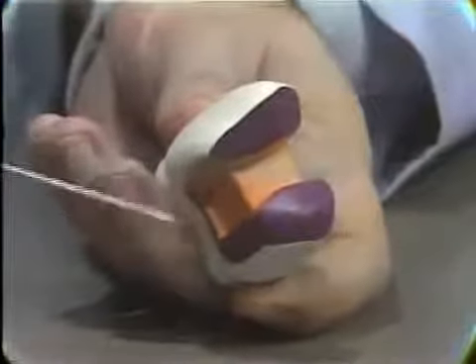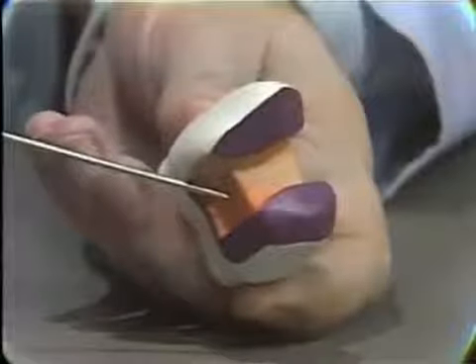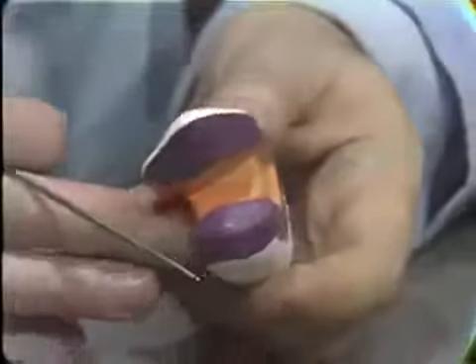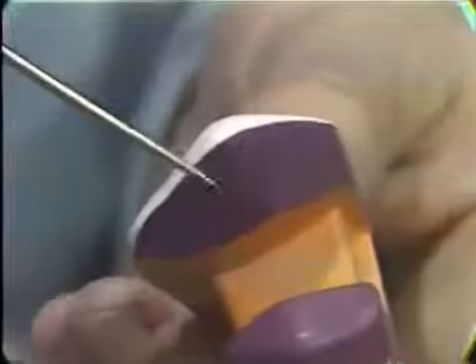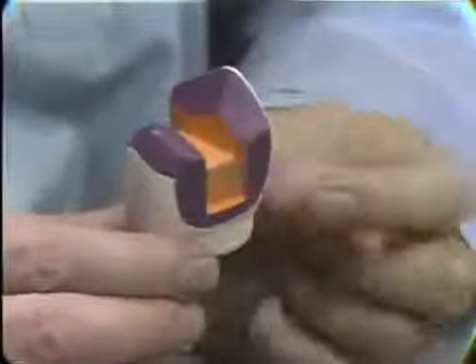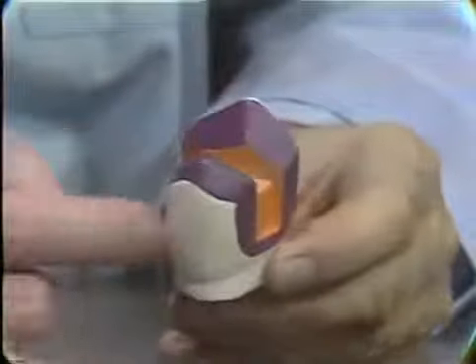Another modification of that situation is seen here and is often used in the maxillary first bicuspid. This preparation has the box type of preparation on the mesial surface here, and on the distal surface has the slice preparation with box retention built into it, and then an occlusal keyway running across. The same control of occlusal protection can be done here as was done in the three-quarter crown, where you give heavier protection to the distal slope of the tooth than to the mesial slope of the tooth. So in a way this is almost like one of the three-quarter crowns that we looked at, except that the lingual surface of the lingual cusp is not cut away and protected.